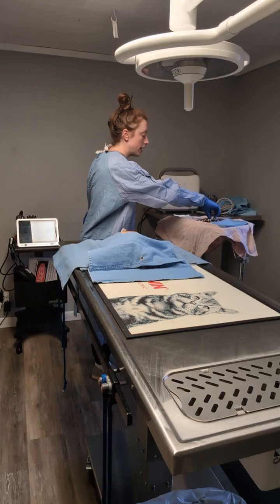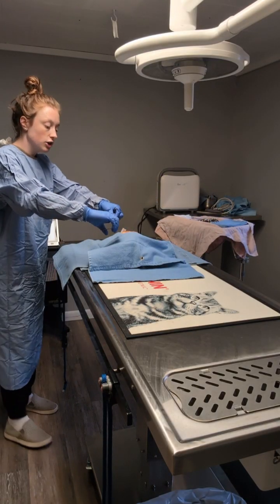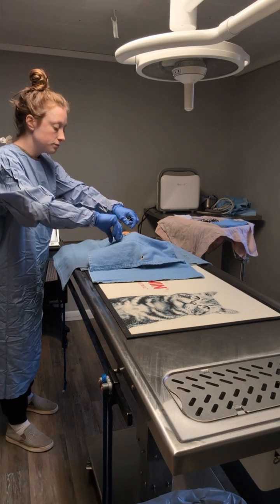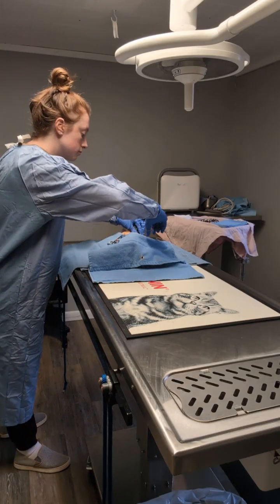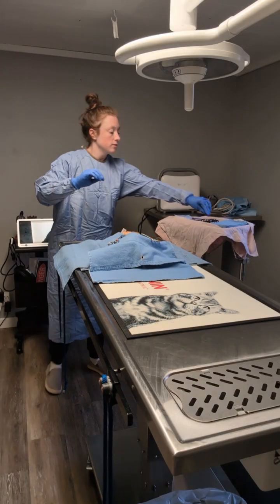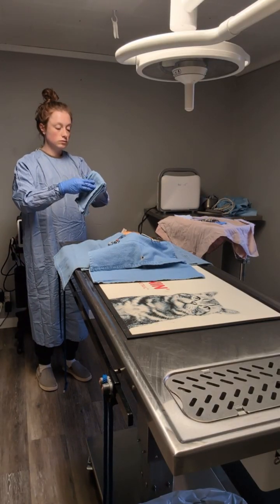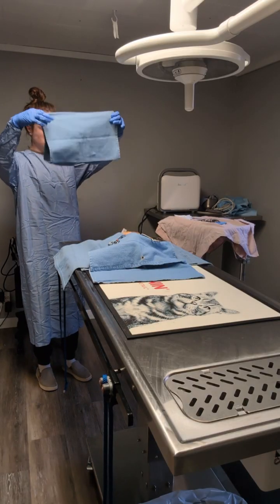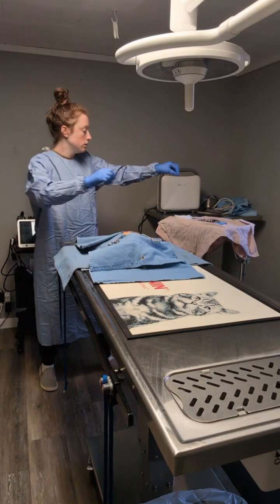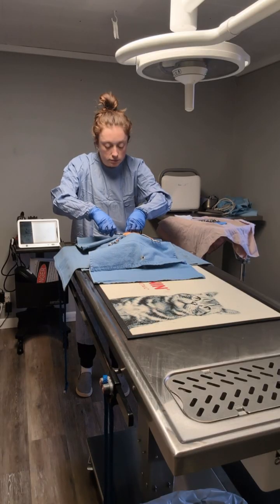This is where I will apply the first 2 clamps, ensuring that the clamps are going through the towel and into the patient's skin. And then I'll place the final towel caudally and place the last 2 clamps on the remaining corners.